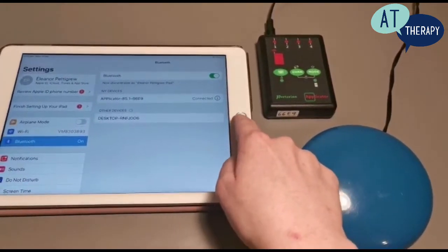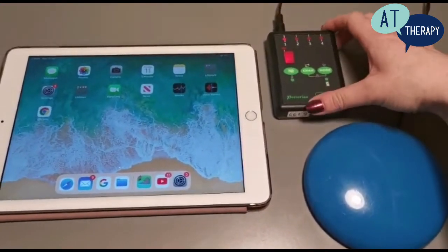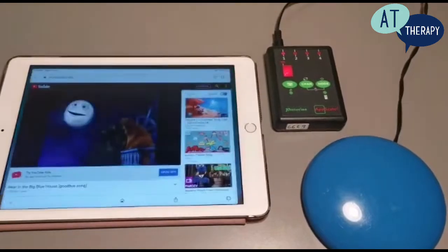Once connected we are going to change the mode on the applicator. In this video we are going to use mode R, which means it should play a video for 30 seconds when we press the switch.